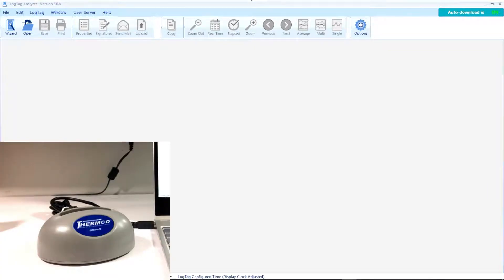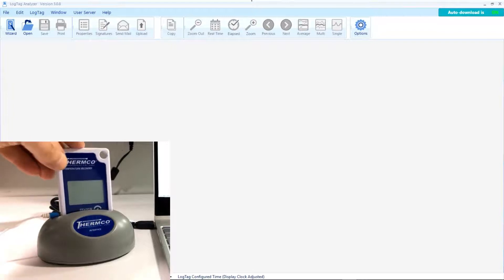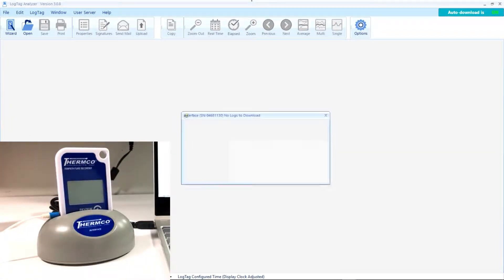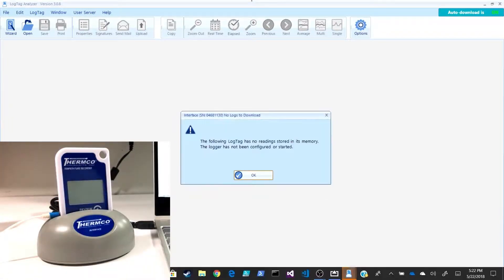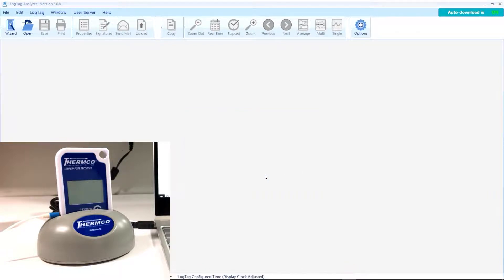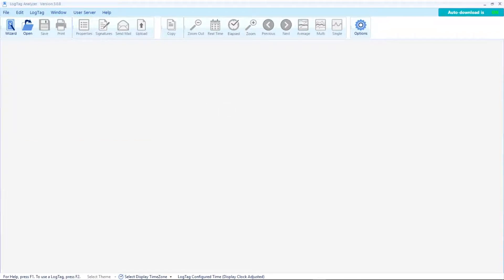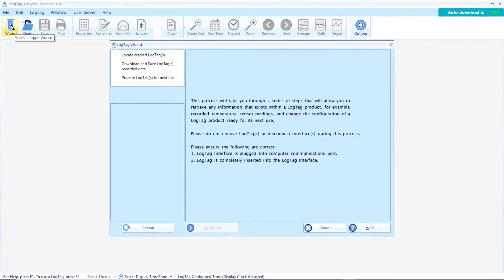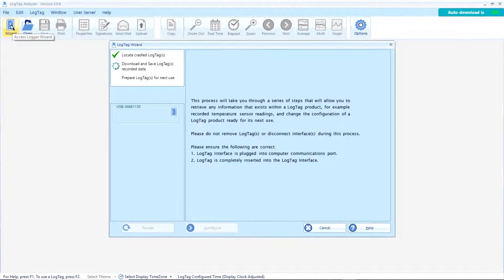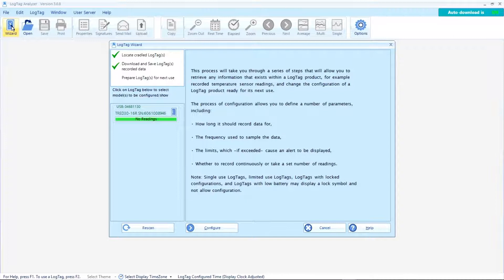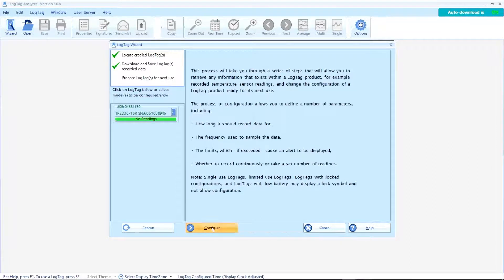Now put the log tag in the cradle and we can click okay or just wait for it and it disappears. Then we click on wizard, wait for it to verify, go down, and click configure.